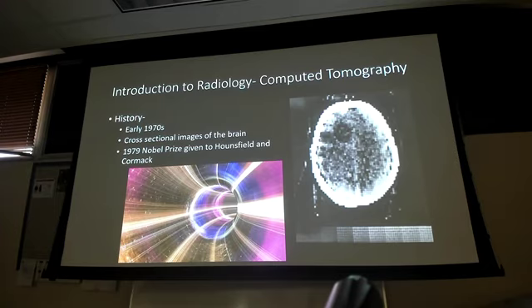The people that came up with it, Hounsfield and Cormack, right? They got the Nobel Prize for this because of the advancements in medicine. And there is something we'll talk about briefly on CTs where you can measure the density of something on a CT with your little screen, not you guys here in this course, but where you're out in practice. You can put a little circle on there and it will tell you the density of something. So you can look and go, is that blood, is that fluid, is that tissue, what is that density? Because of how detailed the CT is, and those are called Hounsfield units. So you did get something named after him for coming up with this, and it's measuring the density of the different tissues on a CT.